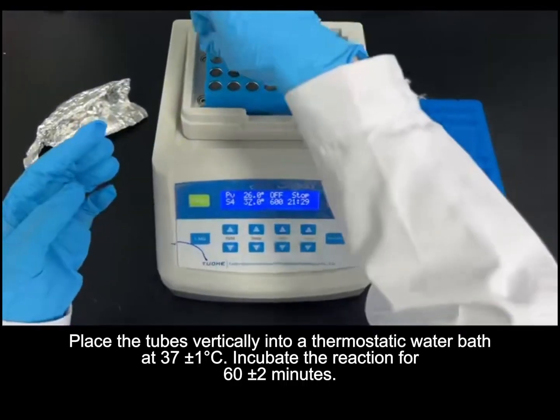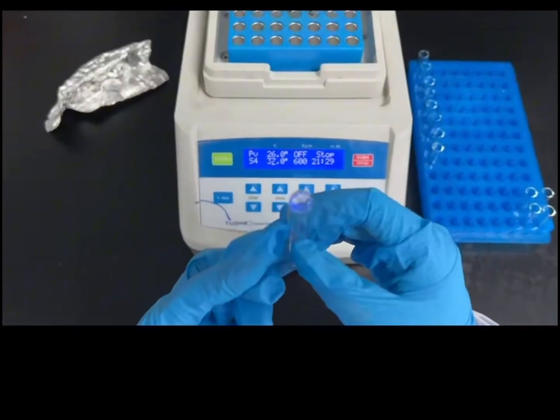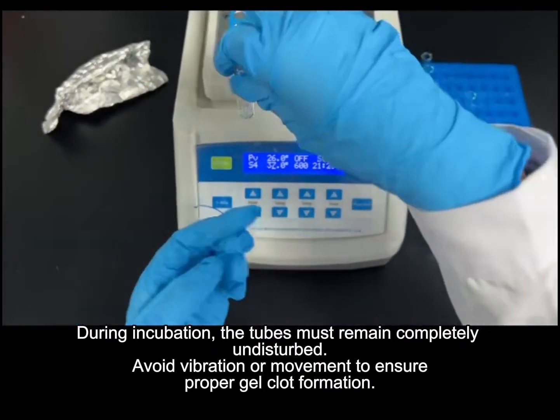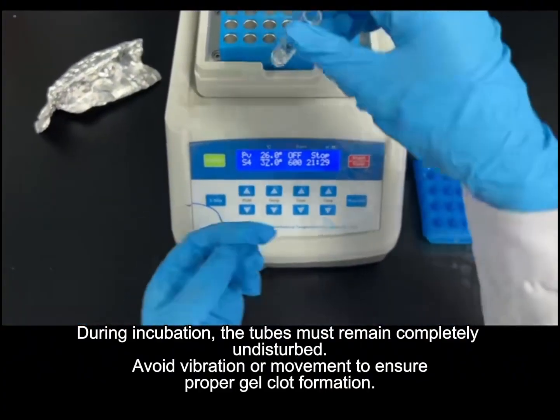After incubation, remove the tubes carefully and invert each tube 180 degrees. A firm gel that remains intact indicates a positive reaction, while a flowing solution indicates a negative result.